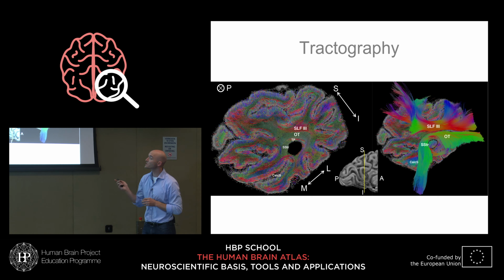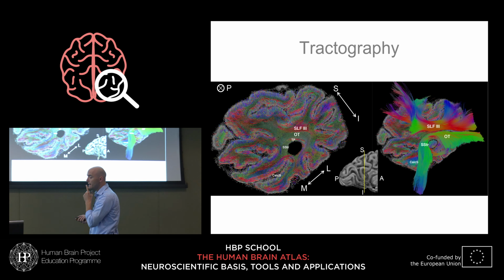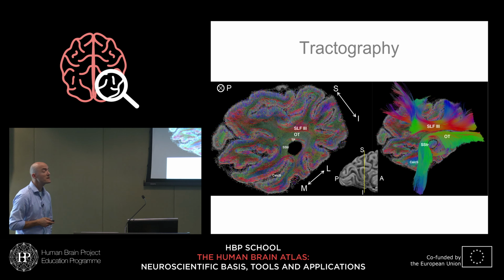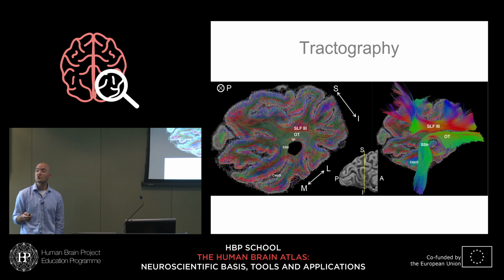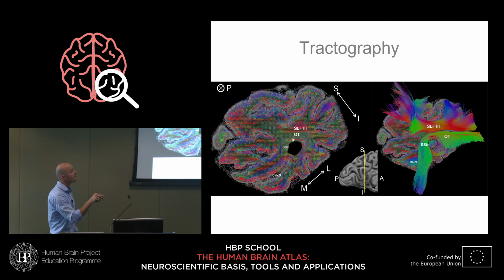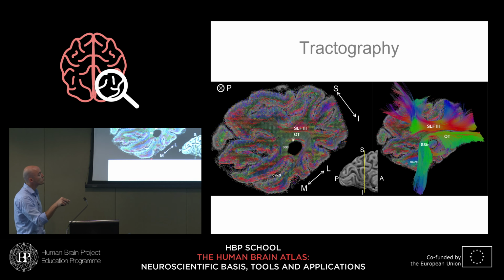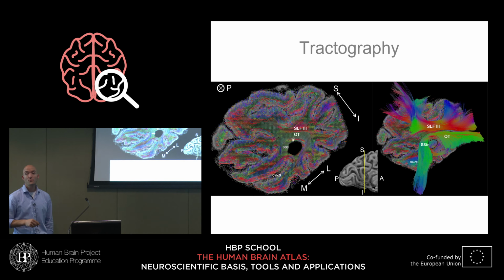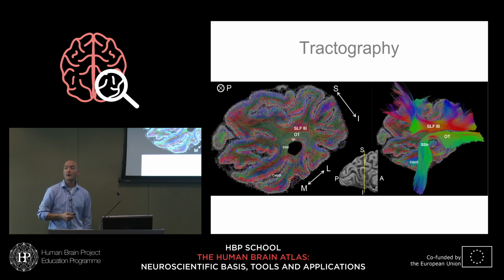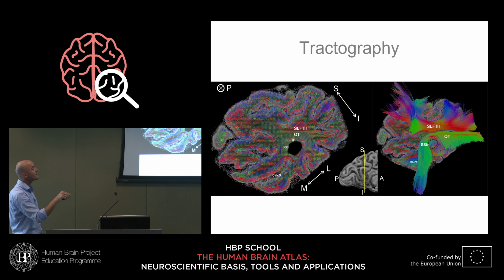Now we use that to do some basic modeling, and there we saw that already this is enough to really start to look at some of the mesoscale but long-range, probably topographically organized connectivity of the early visual system. So here we connect to what Rainer was saying a lot. Rainer has been looking a lot at this part. Here's V1, here's probably V2, and again V2. But we know, of course, that somehow from LGN the fibers will travel into V1. So how did they do that?